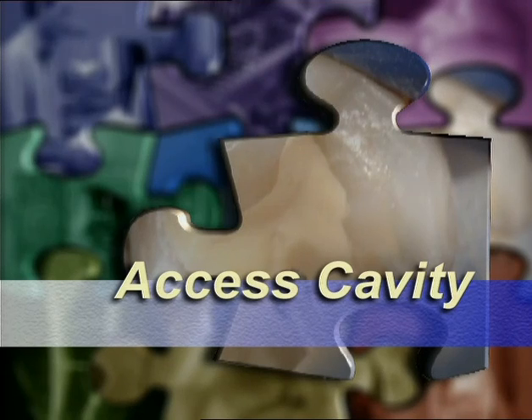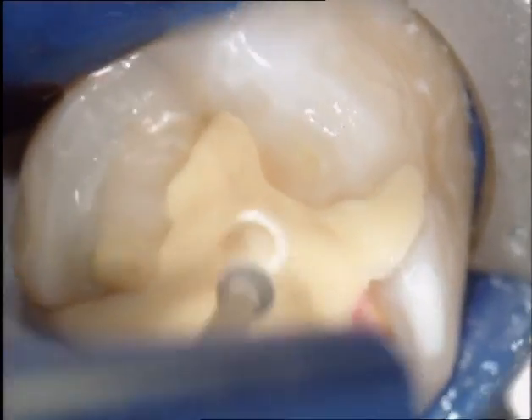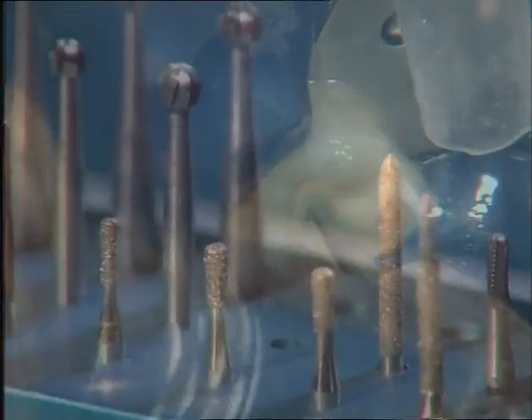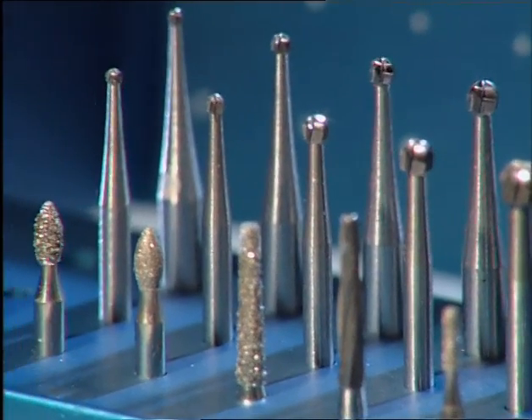The aim of the endodontic access cavity is to create a straight line access to the canal entrance. Old filling material and caries have to be removed. Sometimes it's necessary to build up the tooth first. A specific preparation kit is recommended. Long-shank round burs are used to improve the view for the operator.